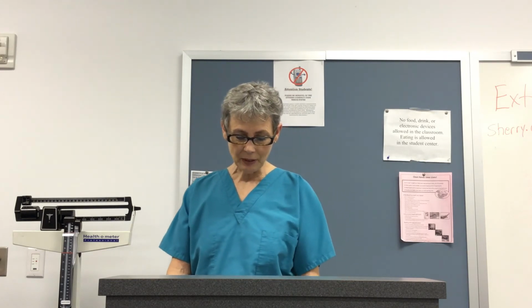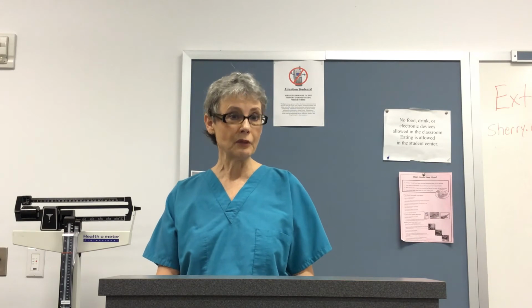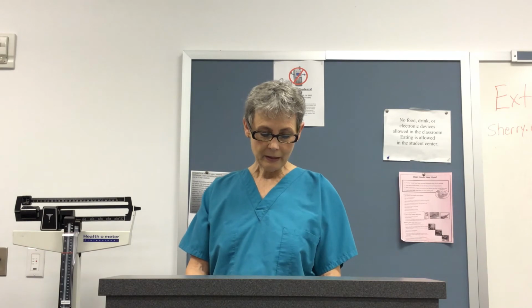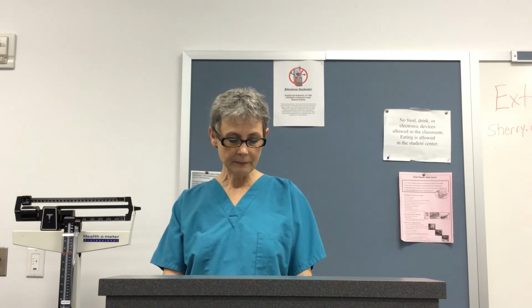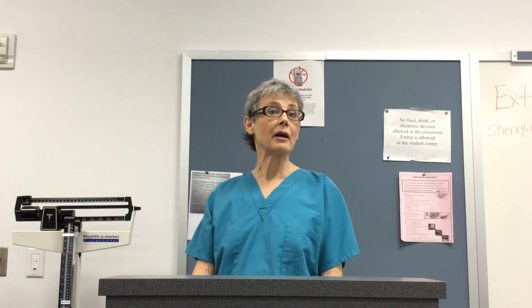Okay, we have to regulate the infusion rate, because we don't want to cause fluid overload, or we want to make sure that our medicine and the fluids are infusing at the right time, on time. We talked about the dial-a-flows earlier today in the video, and I showed you how to count drops and talked a little bit about using a pump.